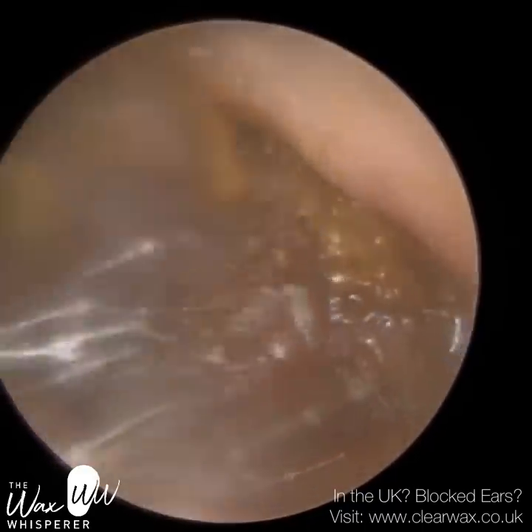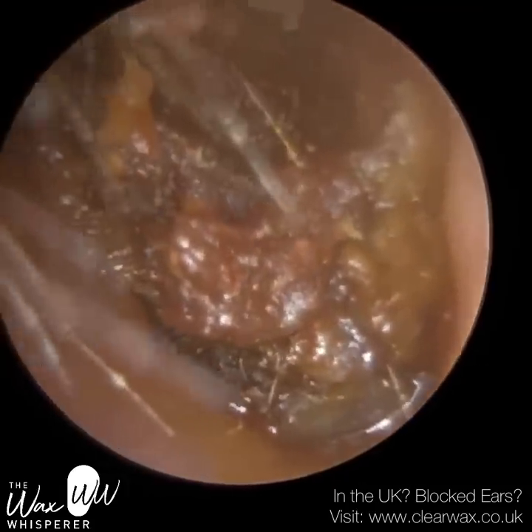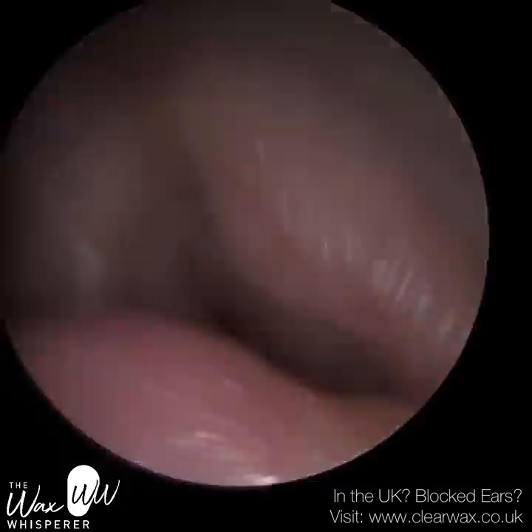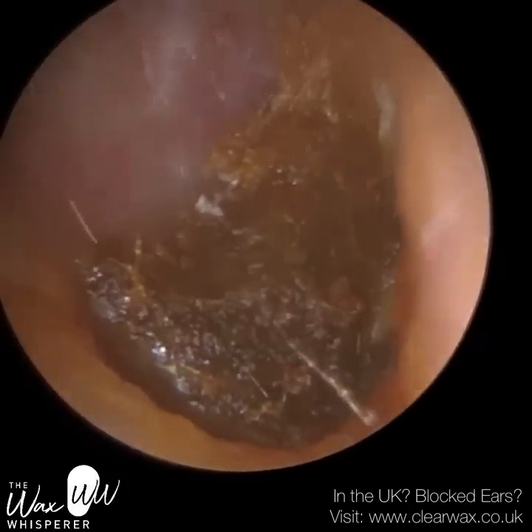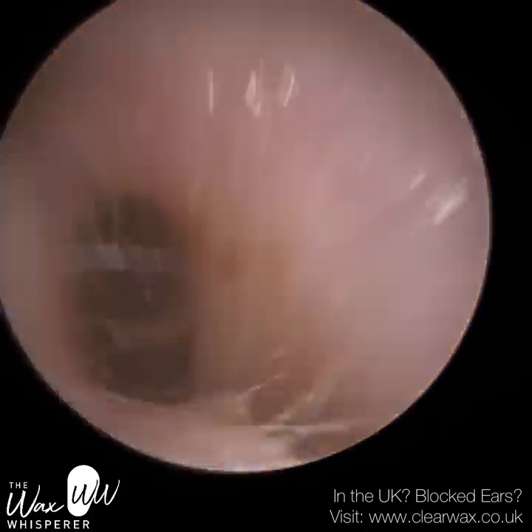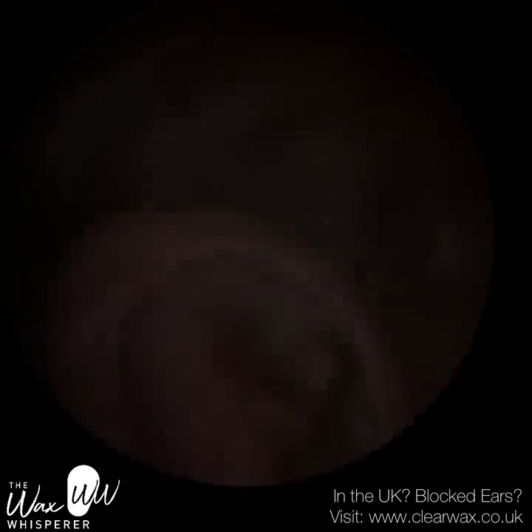As you can see, the oil has worked a treat. I'm just going to come through that narrowing — we're at the midsection now where the ear canal is narrow. The entrance is also quite narrow, so this patient has a couple of narrowings. I'm just going to tease it through this narrow section. You can see it's enveloped in dead skin. I'd say I've got about half of the plug out. There is a gap now over the top of the wax plug, but we want to get it all away. We have to be careful not to overuse the drops, because if we do, it'll make the wax possibly too wet and too loose, and it'll come away in smaller pieces, which makes it a lot harder to clean.